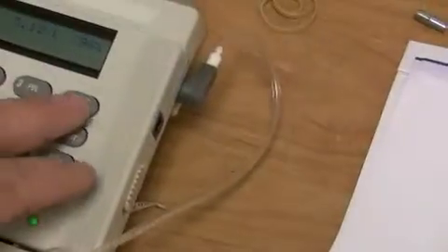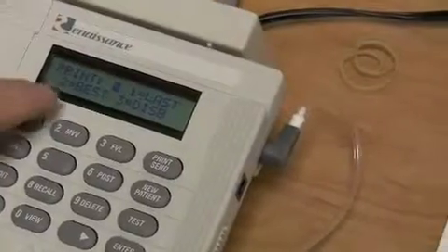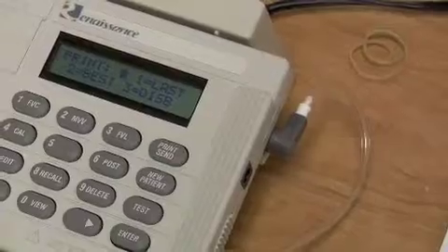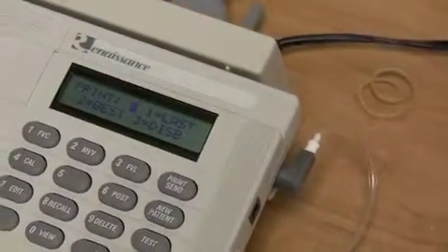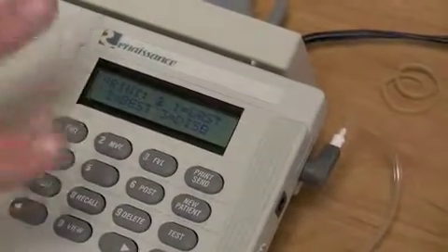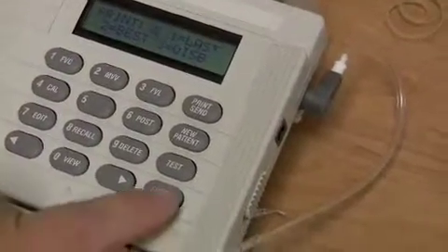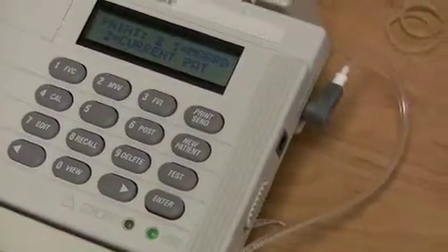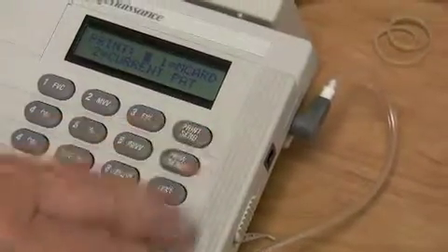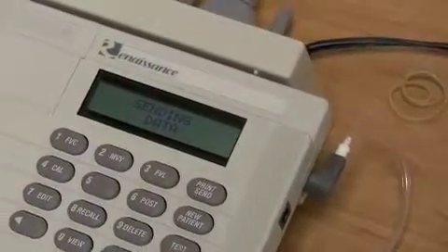And what we're going to do is we're going to hit print send. Okay, print send, and now it gives you the options, as Tim talked about. 1 being the last job, 2 being the best, and 3 is all of them. It gives you all the displays. We always want to print just the best test, option 2. Hit 2, and then hit enter. And now it's going to ask you to print. You're going to print the current patient, which is option 2. And hit enter. And now it says sending data.